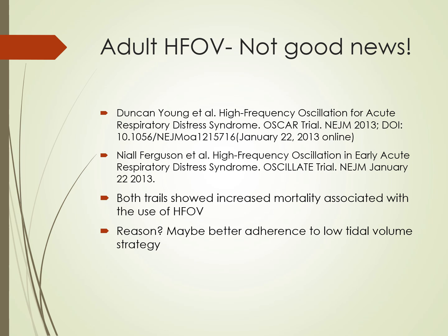Two studies were done in 2013, one by Duncan Young et al. and the other one by Niall Ferguson et al. Both of those studies showed an increased mortality associated with the use of the high-frequency oscillator ventilator, and they feel that the low tidal volume strategy may be the best bet to use with these patients with ARDS. So the high-frequency oscillator ventilator did not work too well for this group.